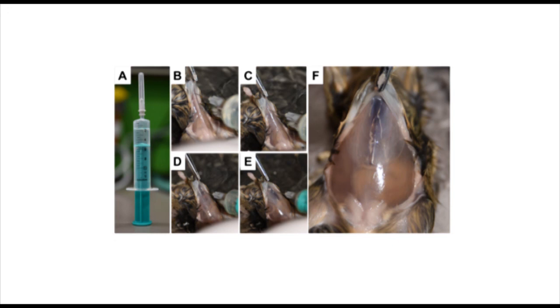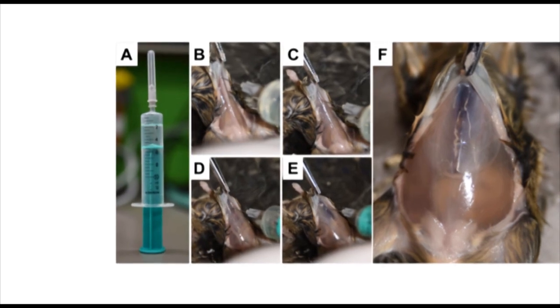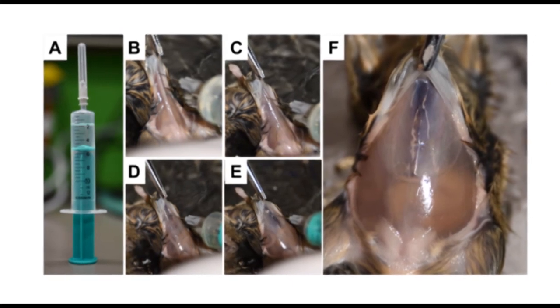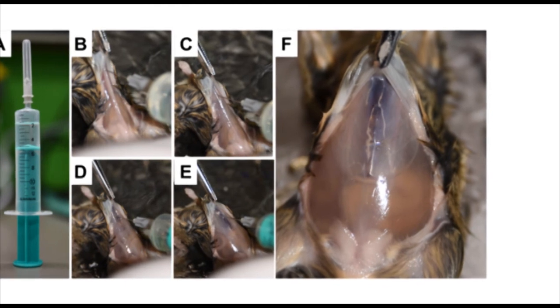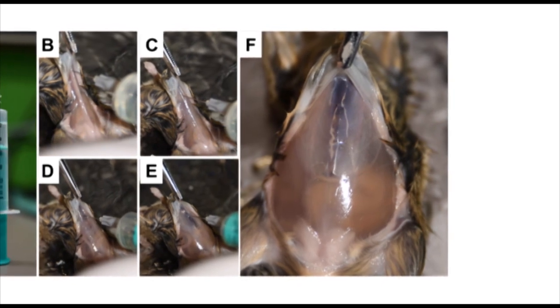Using a scissor and forceps, the outer skin is cut and the inner lining covering the peritoneal cavity is exposed. About 5 ml of ice cold PBS with 3% FCS is injected into the peritoneal cavity using a 27 G needle, and the peritoneum is gently massaged to release the macrophages attached to the peritoneal wall.